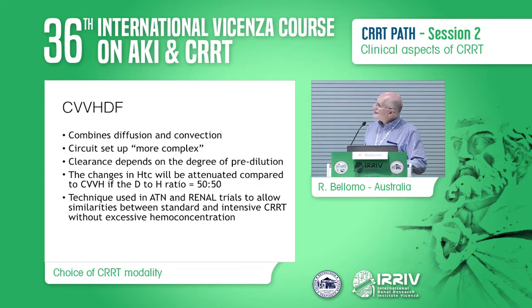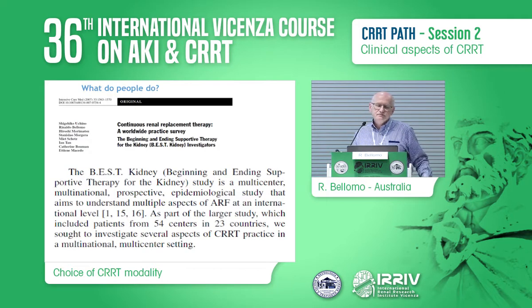But this was the technique that was used in ATN and RENAL. And it was used not because we thought it was the ideal or perfect or optimal modality, but because it made it technically easy and possible to deliver high and low dose without modifying the clearances due to the design of the modality. So there's quite a menu, quite a combination.